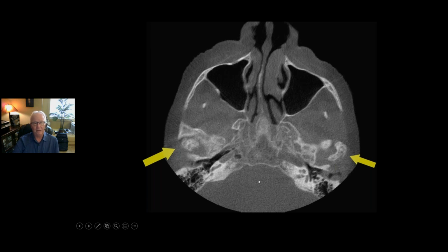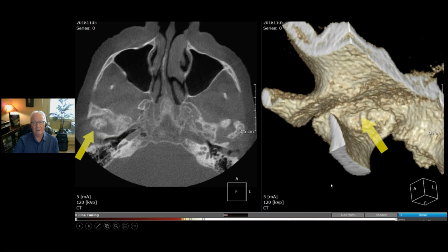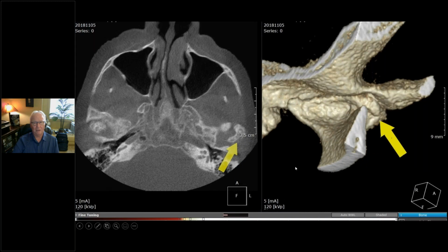This is axial plane of section. You can see subchondral cyst formation, gross remodeling, both condylar heads, osteophyte formation here. So my feeling is that you should, this is a terrible case to image too. It didn't have a lot of high detail in it, unfortunately, but definitely both a bilateral osteoarthritic change and gross remodeling. This is called lipping here on the condylar surface.